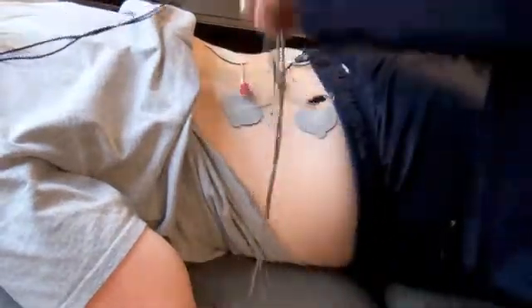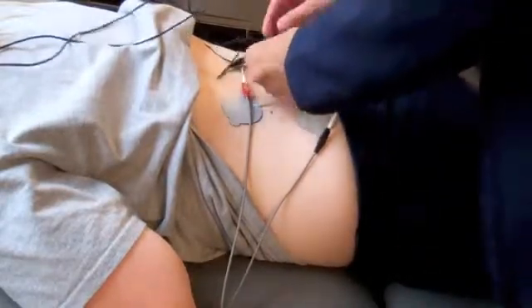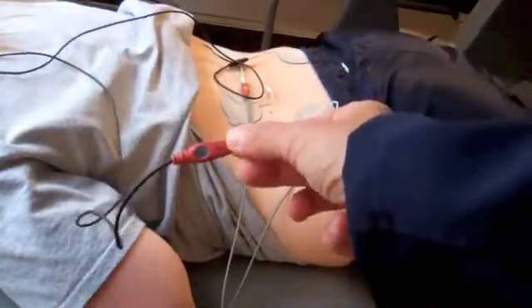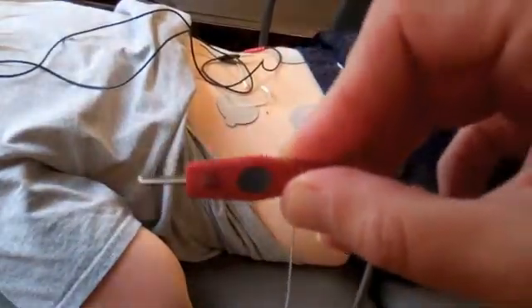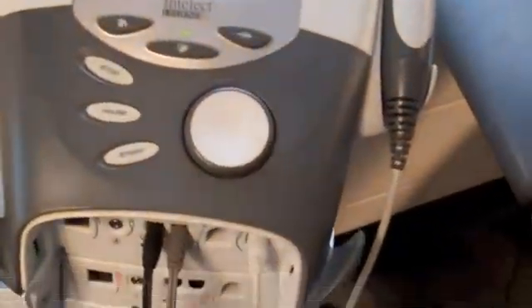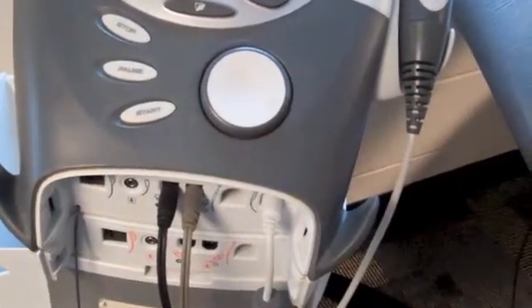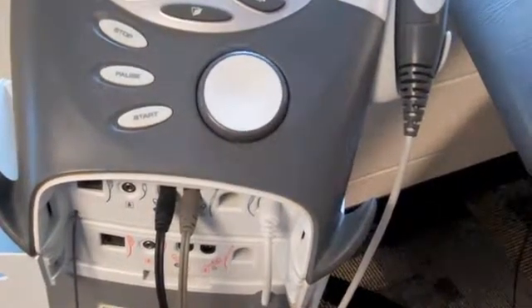And then this is lead 2. Also a reminder that these leads have numbers on them. So I don't know if you can see that, but this has a little 1 right beside my thumb there. And then this one has a 2 written right there. That corresponds to the channel portal. So lead 1 was the black one, and lead 2 was the gray lead.